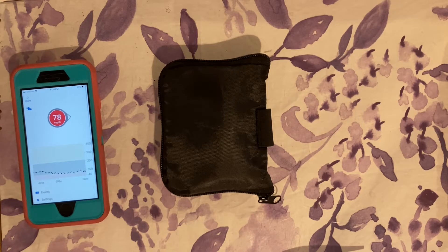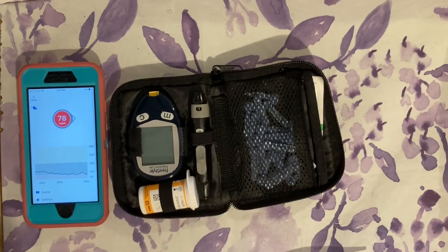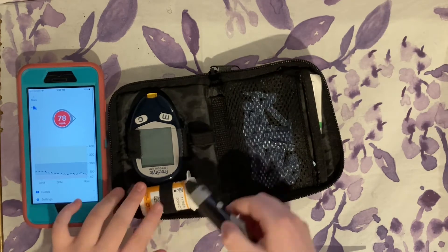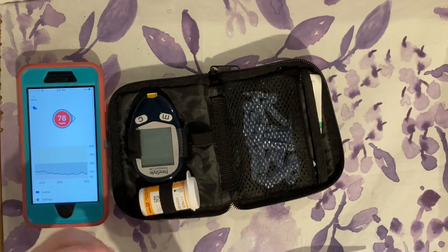I've already done a video on how to check your blood sugar, so I'm not going to go super in depth. I showed how to use three different lancing devices as well as my glucometer and ketone meter. Right now I'm going to use the Abbott Freestyle lancing device.